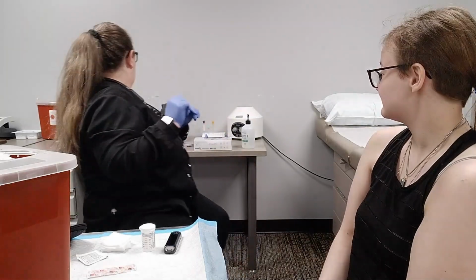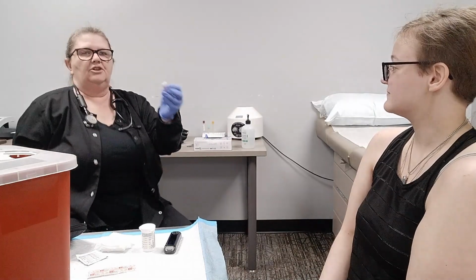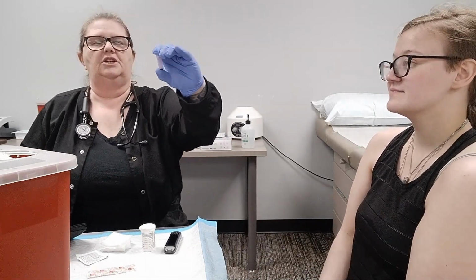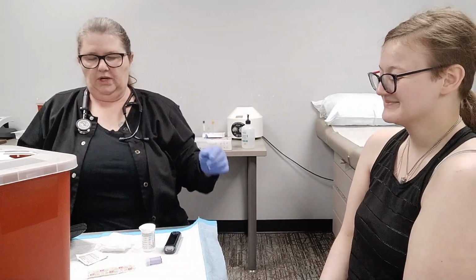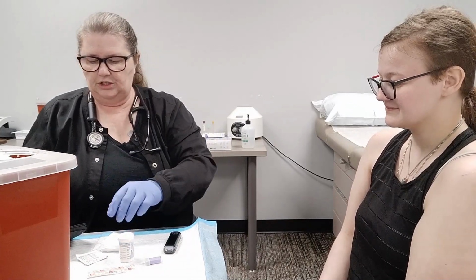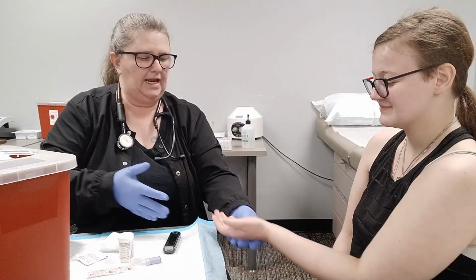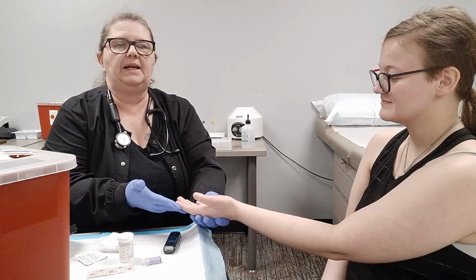All right. One thing I do not have is a lancet. Here are the lancets that I like to use. They're pressure lancets. These are the greatest, my favorite. Okay, so next we're going to go ahead and inspect the hand. Do you have a preference? No. No? Okay.